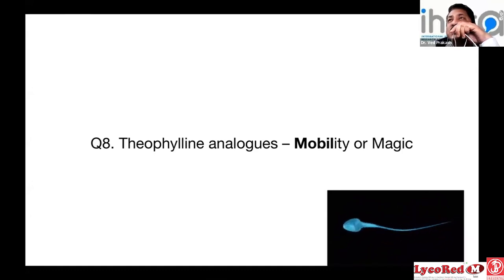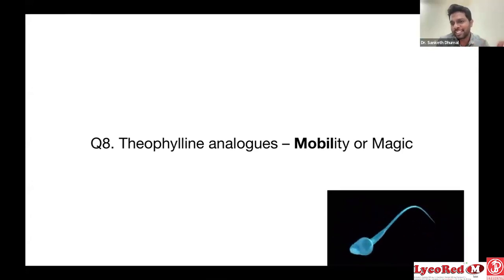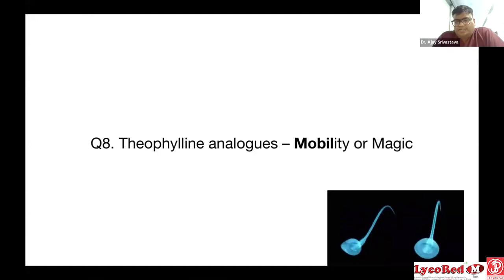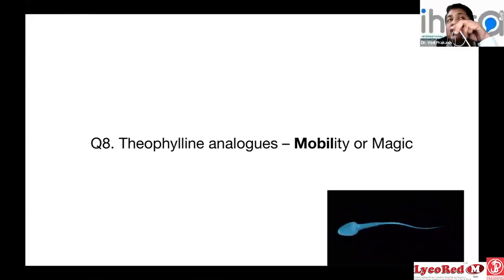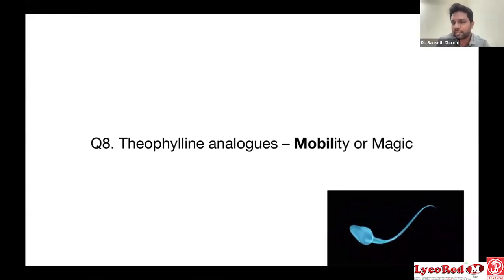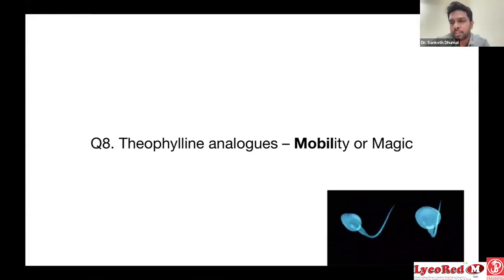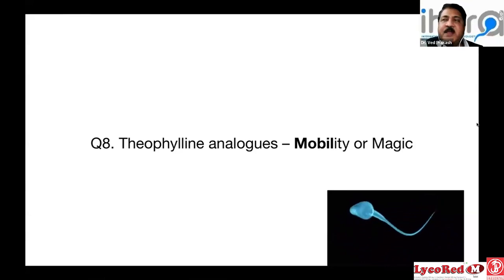Yes, of course, I am using this and it is very useful in some patients. It makes your job very easy, sir. Even in macro patients, and for the TESA sample after thawing, after warming, this is very useful. I am using collagenase also in TESA samples. It really helps. For example, today I sat for 1 hour in search of sperms, looking for motility, and I didn't find any sperm. Then, as a last-moment rescue, I added theophylline. Within 10 minutes, I got around 5. Yes, it is very useful actually.